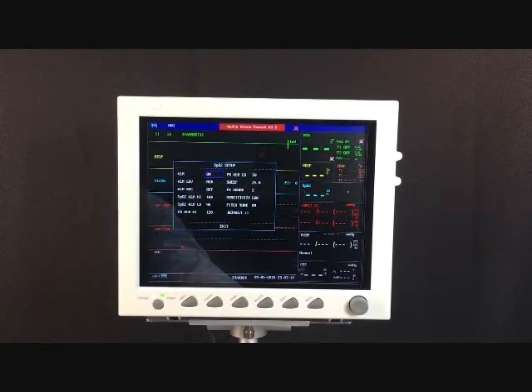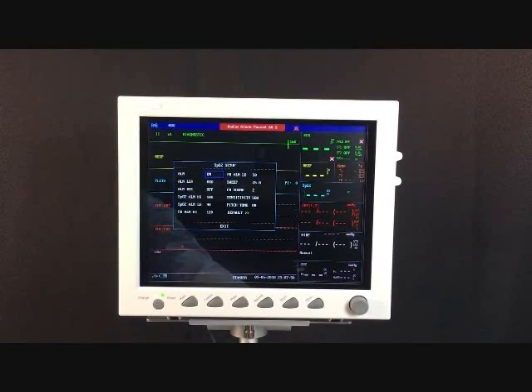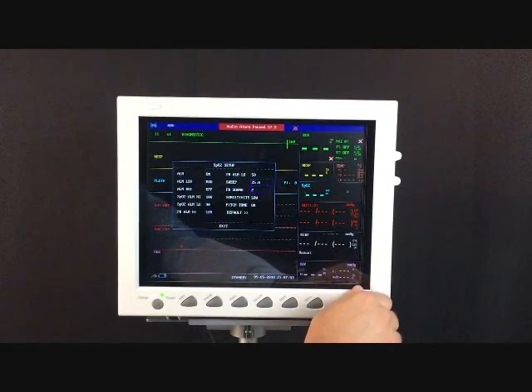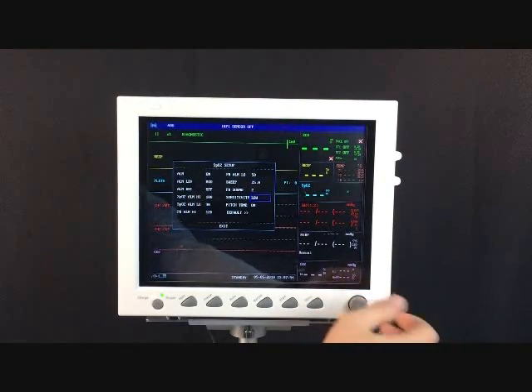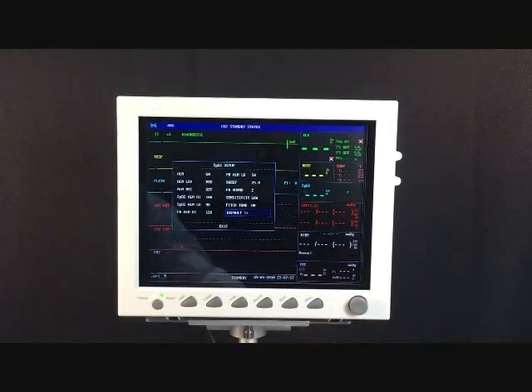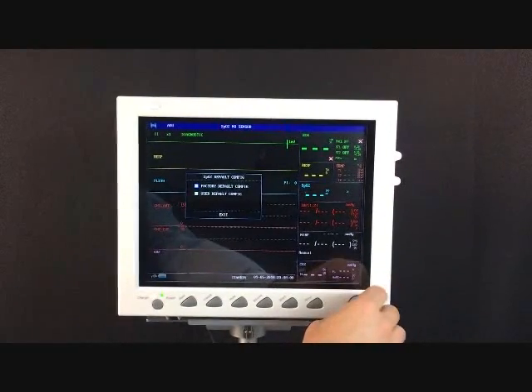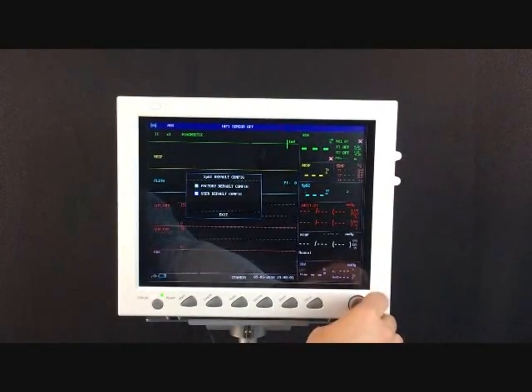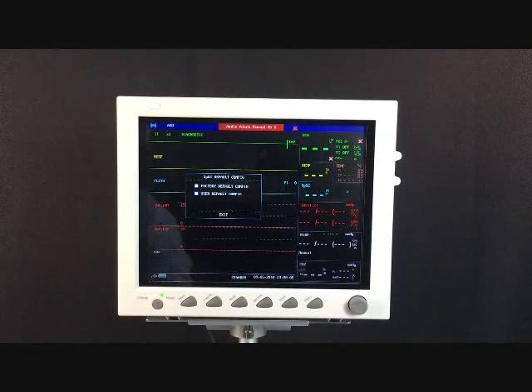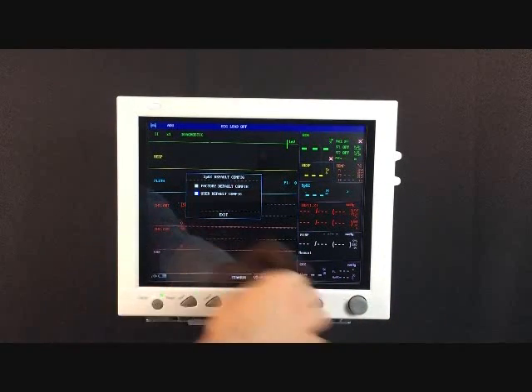This is where you can control the alarm settings for all the different parameters, as well as some settings like volume and pitch tone. If you need to go back to any defaults, all defaults can be selected here as well — either the factory default that the manufacturer has set up, or your own custom default that you have set up.